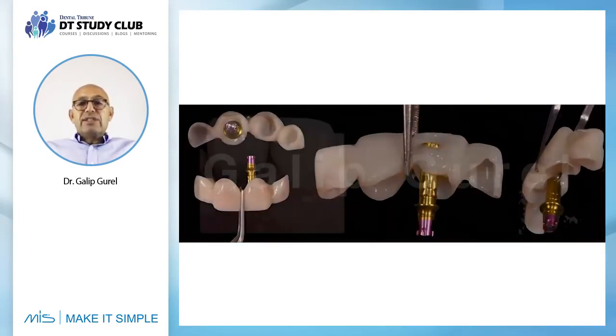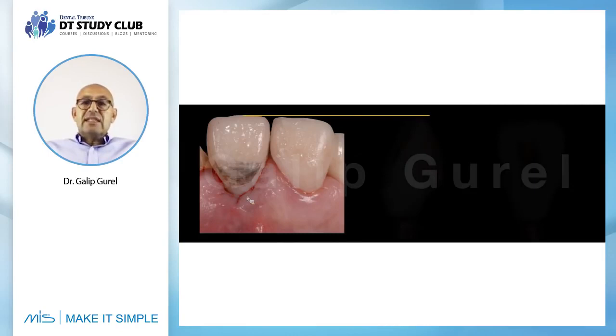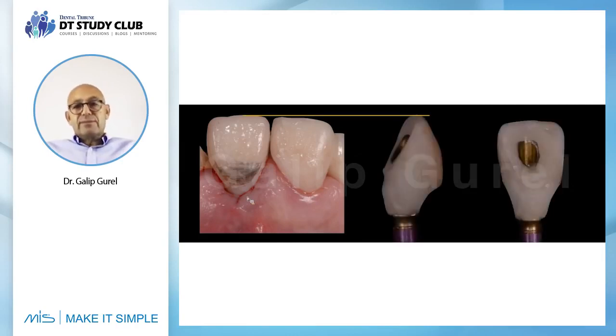What we will try to do is to adapt it into this implant head. So this is the provisional we had, and look what happens here. This is very important for all the prosthodontists and the implantologists to define the area which will dictate your soft tissue if you have properly augmented the space or not. So what happens is that this is the incisal edge that corresponds to our provisional. This is the area where the facial side is the thickest. This is the critical zone that dictates sort of the gingival outcome.